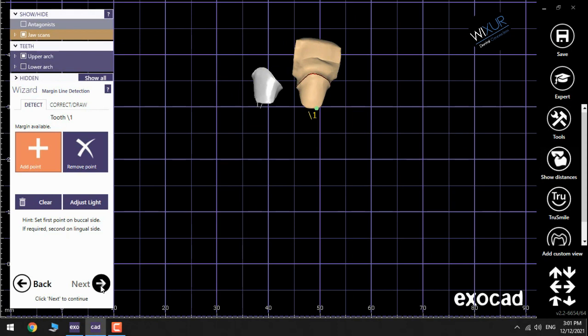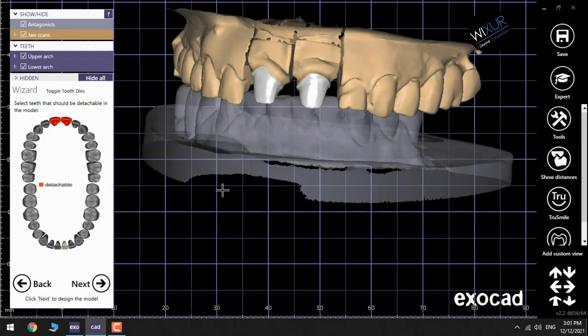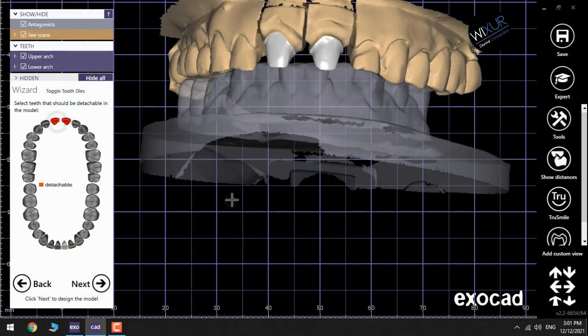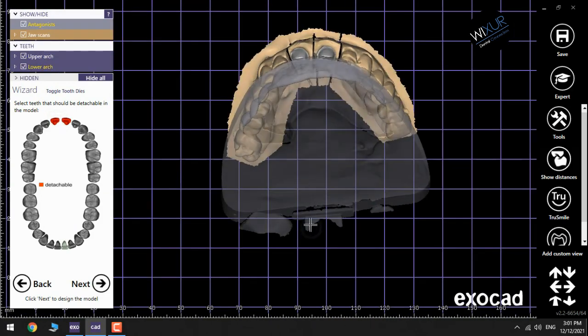Now the software wants a confirmation of what tools should be selected. That is correctly done. Click Next.